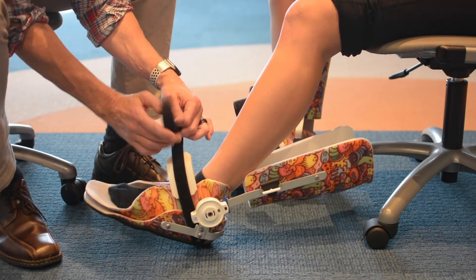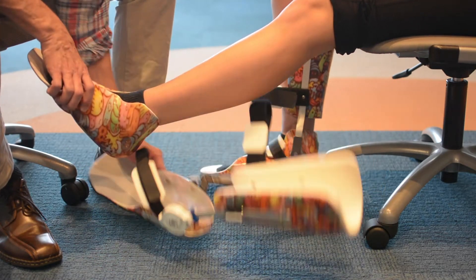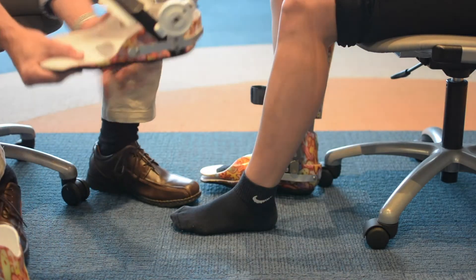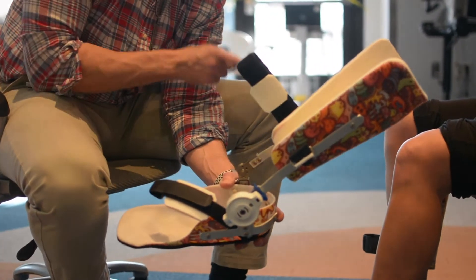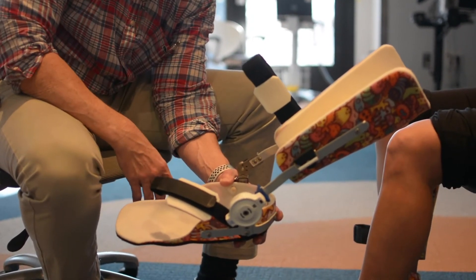Then just take and close all the Velcro straps. Take this off and then take the inner boot off — it's ready to go. Just to point out, I locked this in a position where the Velcro straps are set, so when I go to put this back on I don't have to redo the lock.